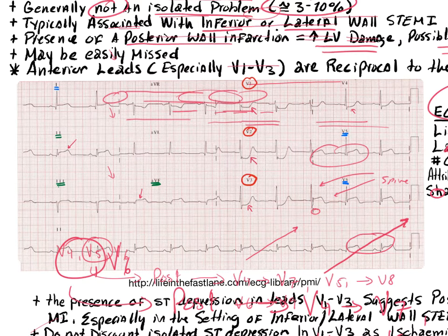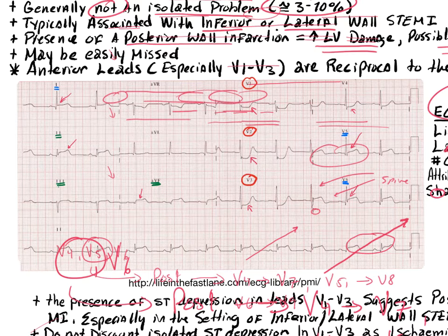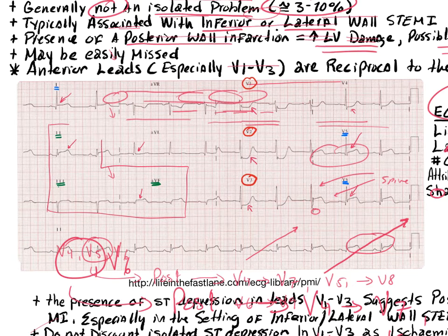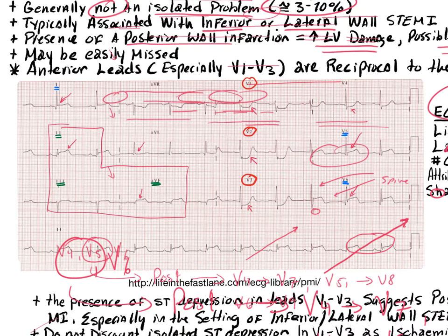Looking at the lateral leads: V5 shows slight elevation, V6 a little elevation, lead 1 ever so slightly elevated, and AVL not much going on. So we're looking at an inferior wall STEMI with possibly a little lateral involvement and reciprocal changes in the anterior leads.